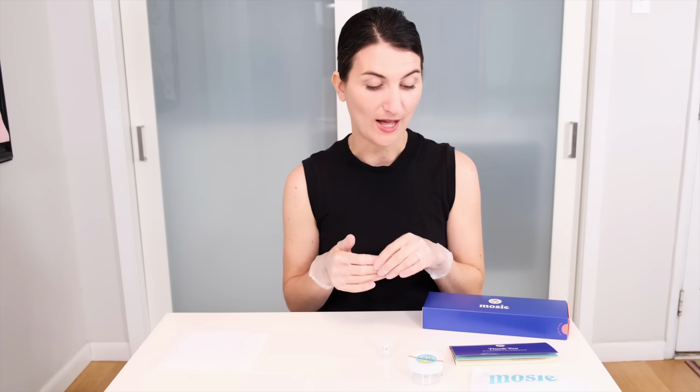And you want to double check it. You'll use an ovulation predictor kit or some sort of tool at home. And we encourage you to check your cervix and your cervical mucus on your own. So you can look for information on our website on how to do that. We'll link it below as well.